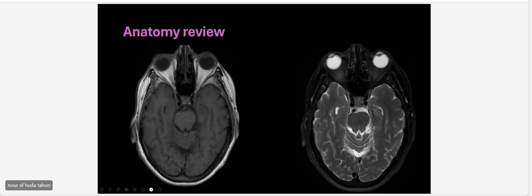Yeah, exactly. You know it. Oh, wow. So, the aqueduct of Sylvius has something important about it, because when the patient has hydrocephalus, we can differentiate the communicating from the non-communicating by looking at the aqueduct of Sylvius.